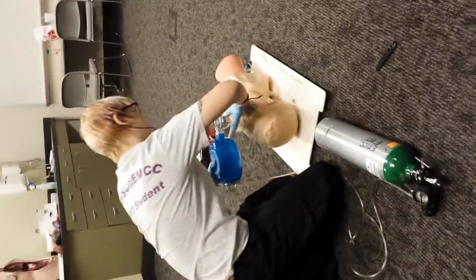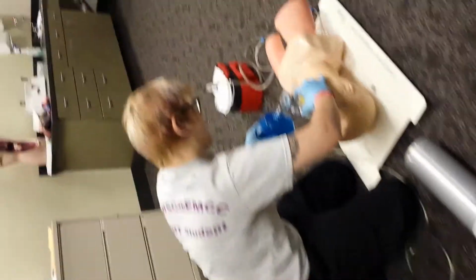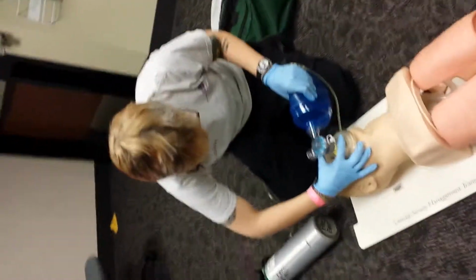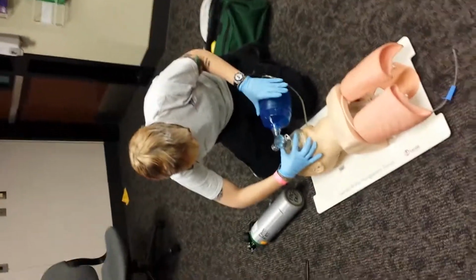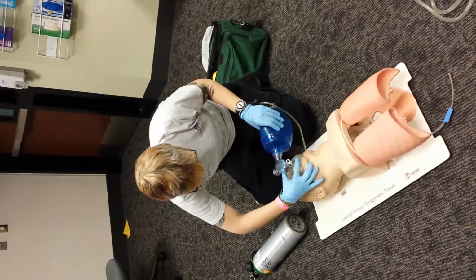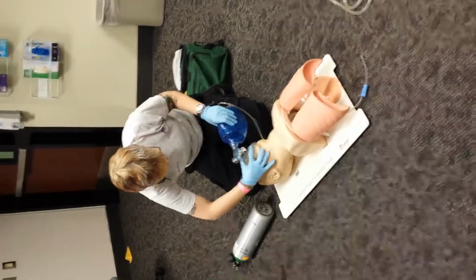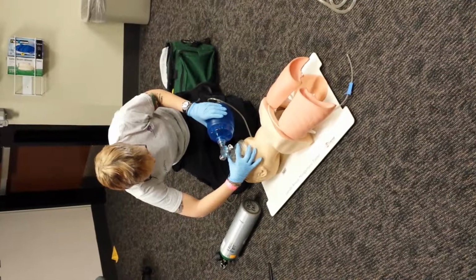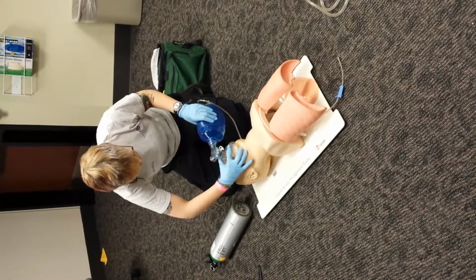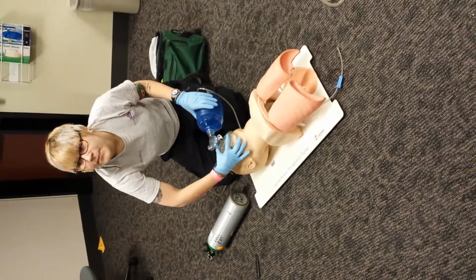I'm going to do the C and E grip. I'm going to do 2 seconds in, 4 seconds out. 1, 2, 1, 2, 3, 4, 1, 2, 1, 2, 3, 4. Ventilation is being properly performed without difficulty.